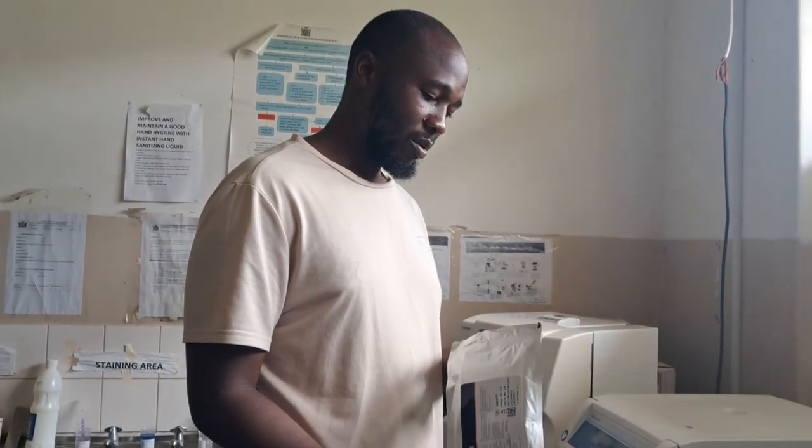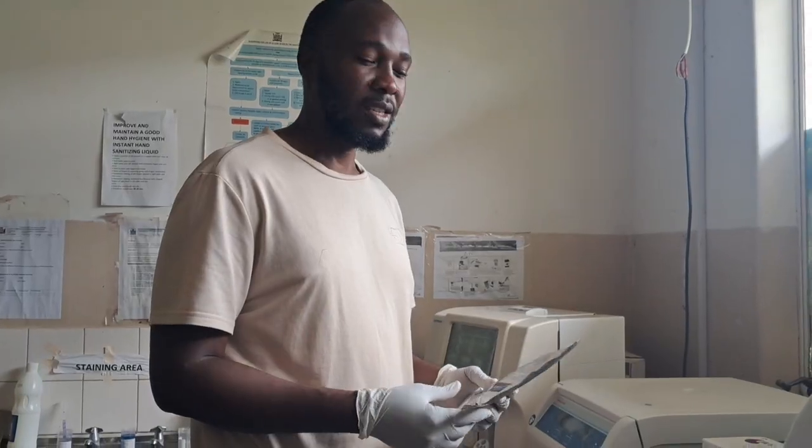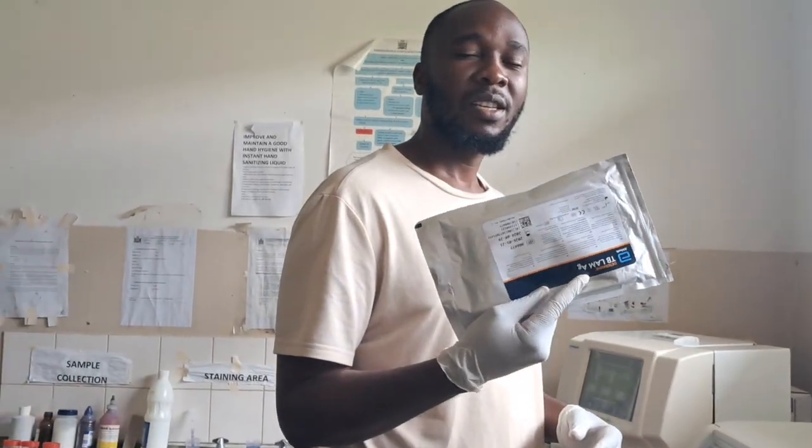So let's go into the video again and see how the lab tech will do the procedure for us so that we can do this thing on our own. Morning everyone. I'm Kuka Makumba, the lab personnel at Chalavesa Mission. As Madam Kunda started, we are going to go through this simple POC testing kit, urine LAM.